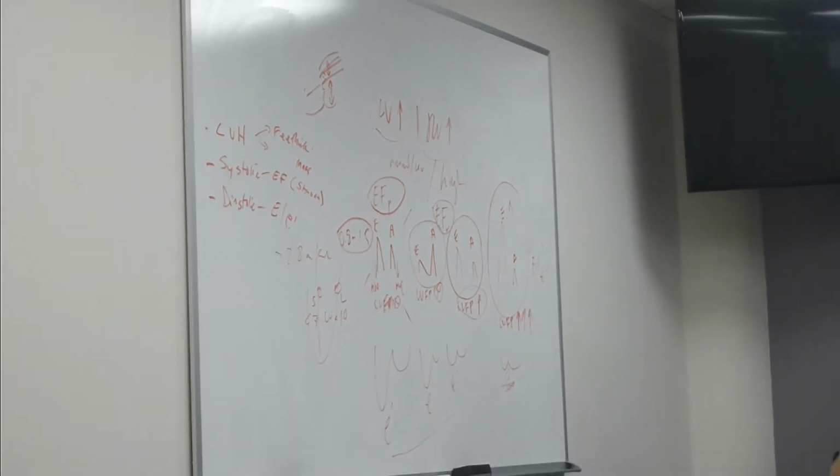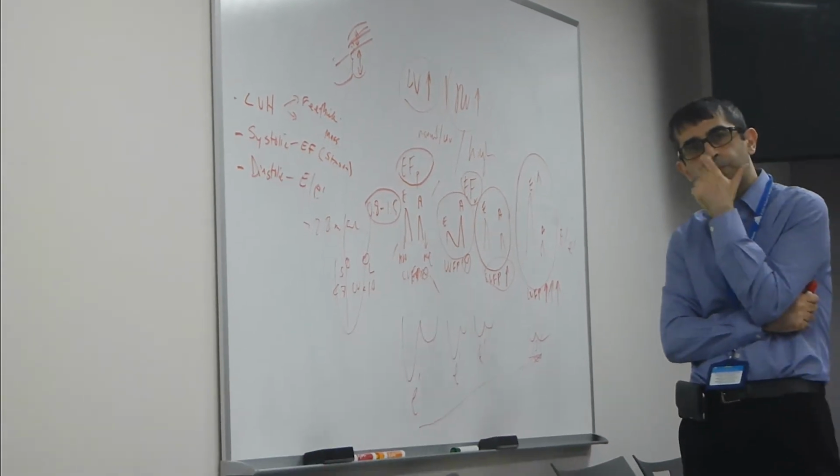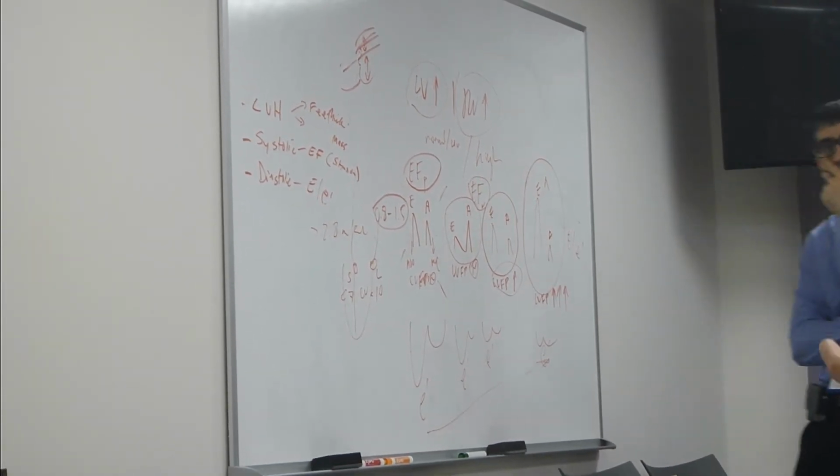Sure. Do we use A prime also in TDI to differentiate the normal and pseudo-normal? It should be reversed, right?